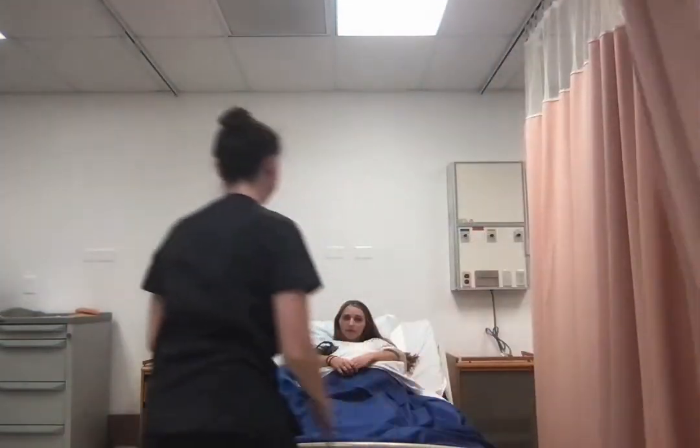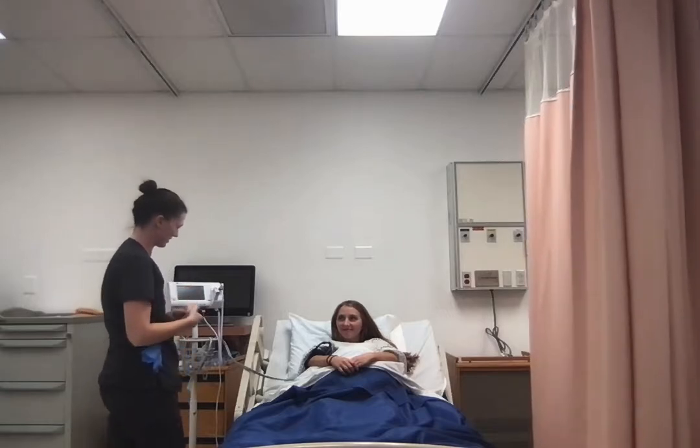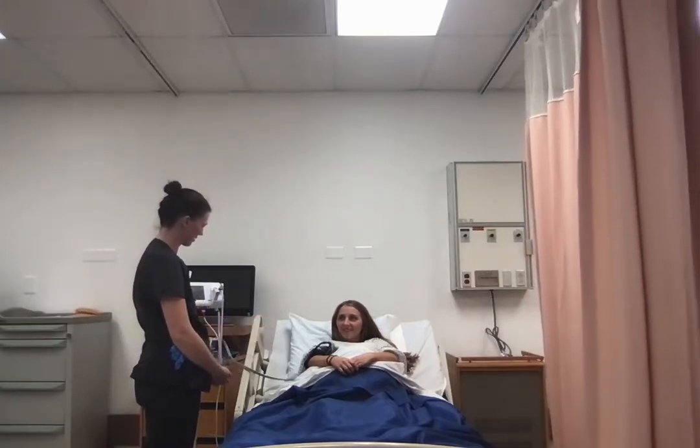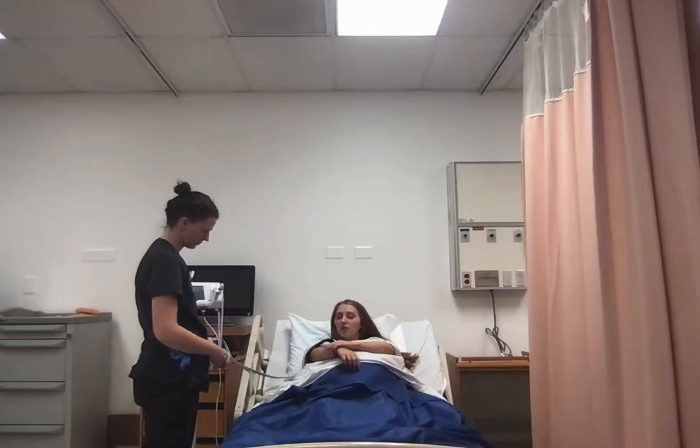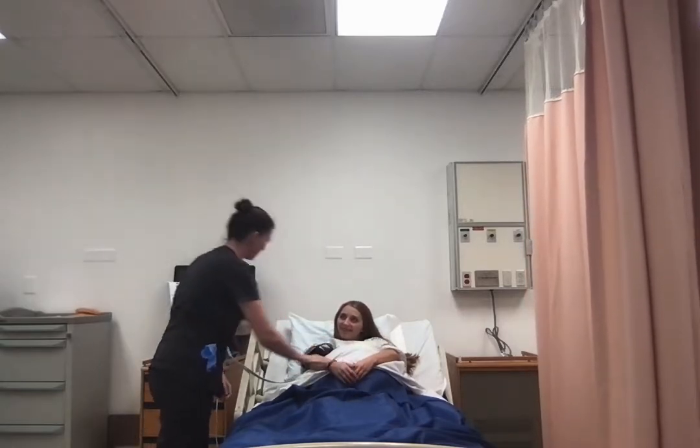Nurse Lake is entering the room. Upon entering the room, she performs hand hygiene. Hi, I'm Lake. I'm going to be your nurse today. Can I please have you state your name and date of birth? Rebecca Banis, January 16th, 1996. That looks good. Thank you.